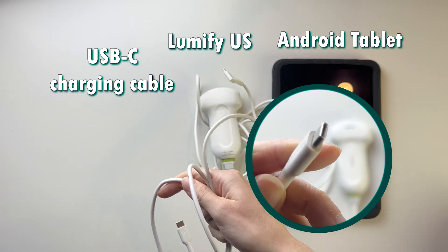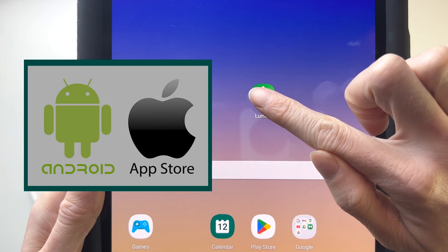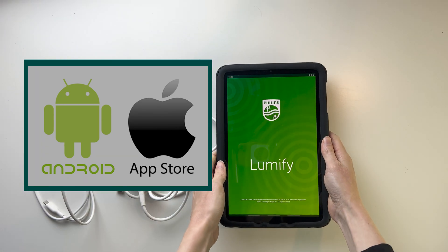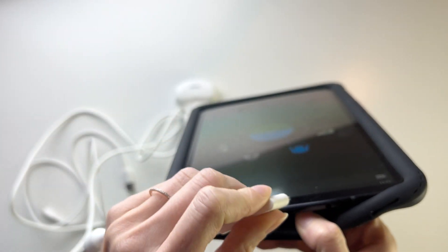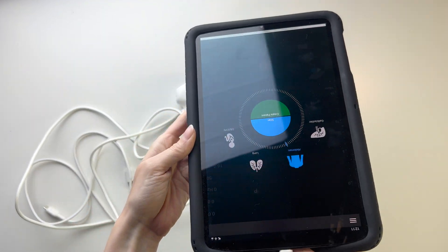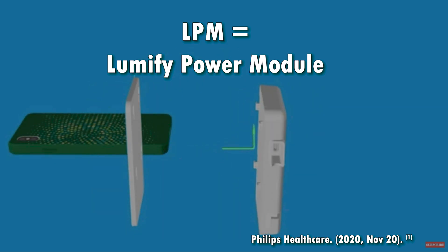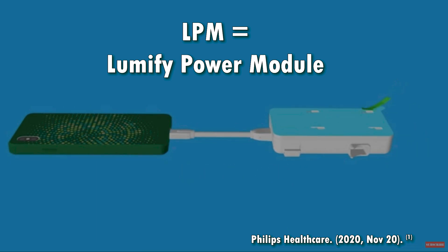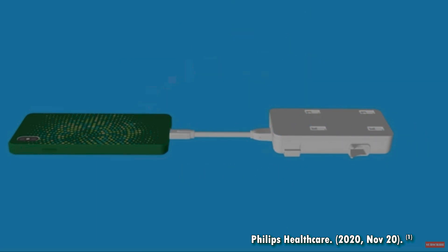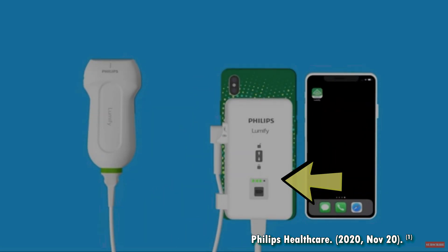The device is technically supported by both Android and Apple. However, it strongly favors Android devices because the Lumify does not have an internal battery and requires power from the USB-C. If you have an Apple device, you'll need to use an LPM — a Lumify Power Module — which is basically an external battery with a lightning connector. Once you hook that on, it works just like normal and has a battery level indicator.